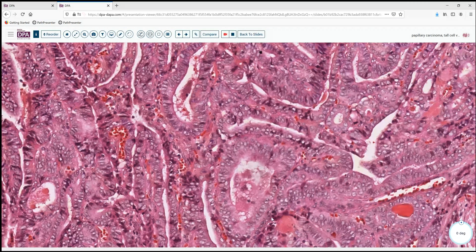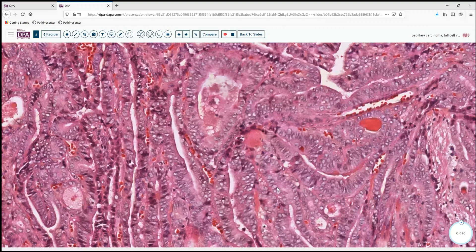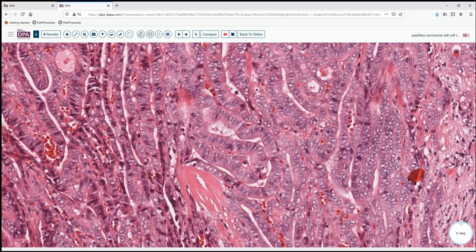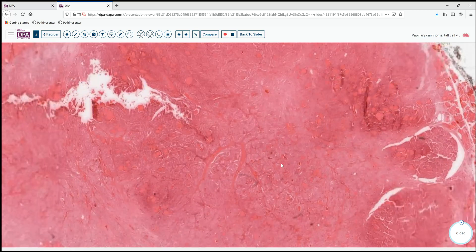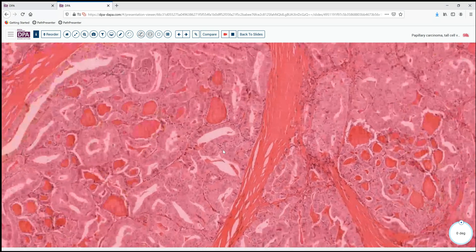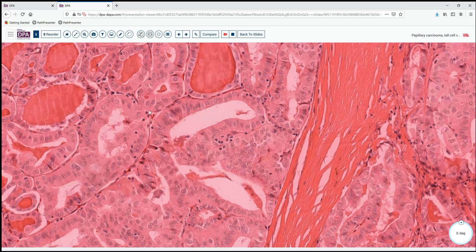Here we see a nice gland where there's lots of cytoplasm and it's pretty tall. Now we're not seeing really sharp cell borders to suggest columnar cells. And we have certainly a lot of nuclear inclusions here, which is also another feature. Here's another area where we've got nice tall cells, more than two times as large as the nuclear structures.